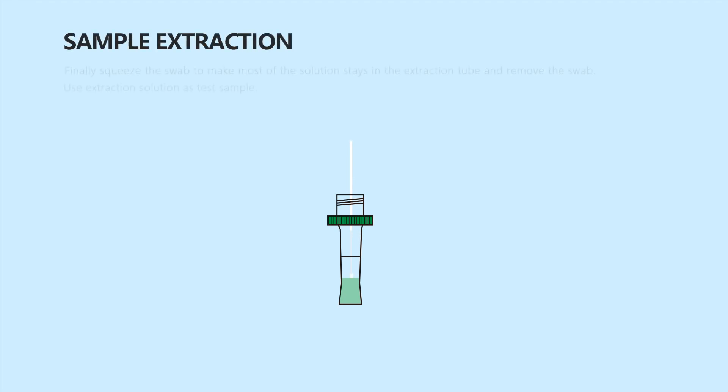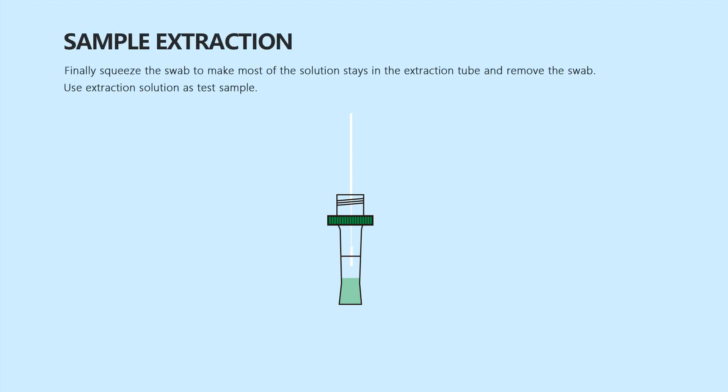Finally, squeeze the swab to ensure most of the solution stays in the extraction tube and remove the swab. Use the extraction solution as the test sample.